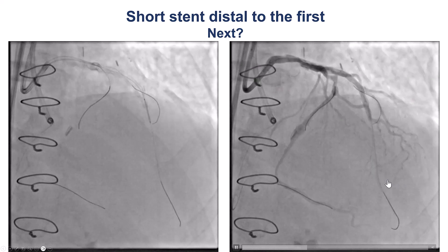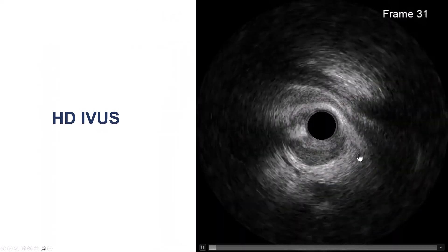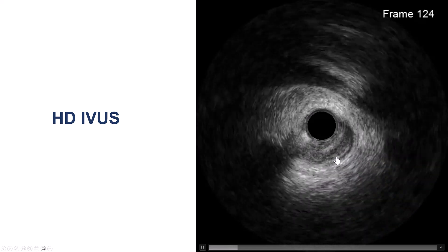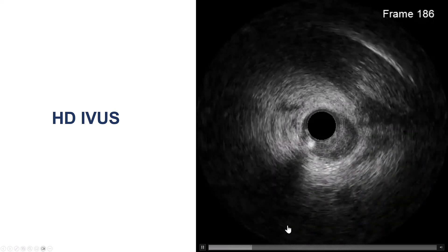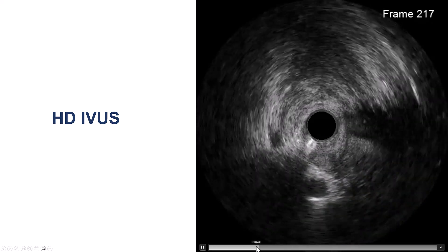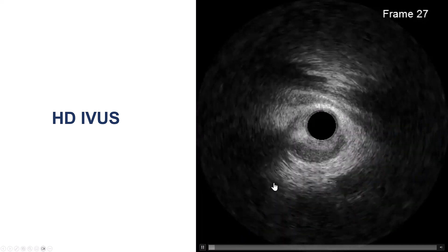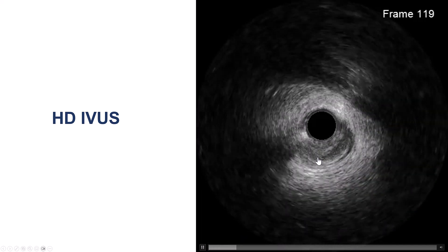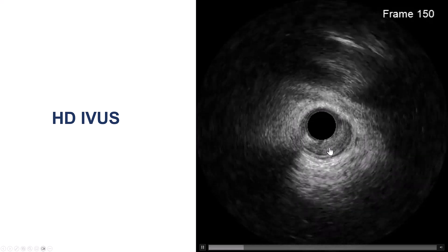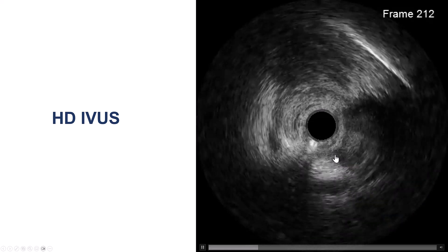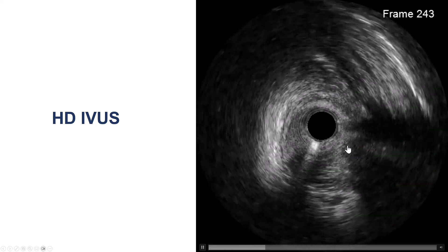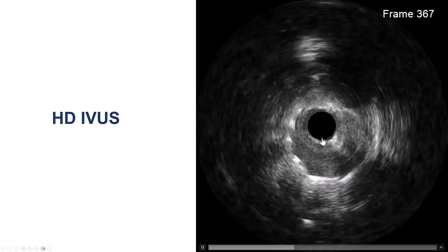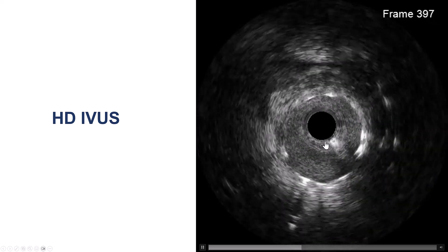So what is going on? We decided to do IVUS, and this time the HD IVUS was available. Coming from distal to proximal, we're seeing this structure, which is the compressed true lumen in the distal portion of the vessel. What had happened is that we had stented literally into the extraplaque space.